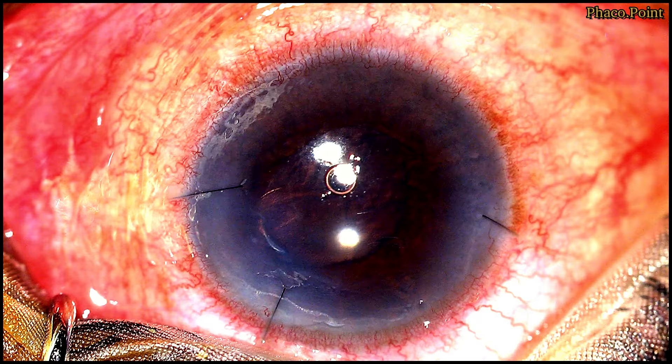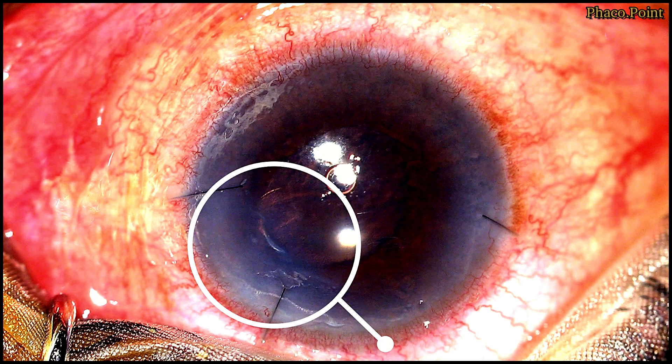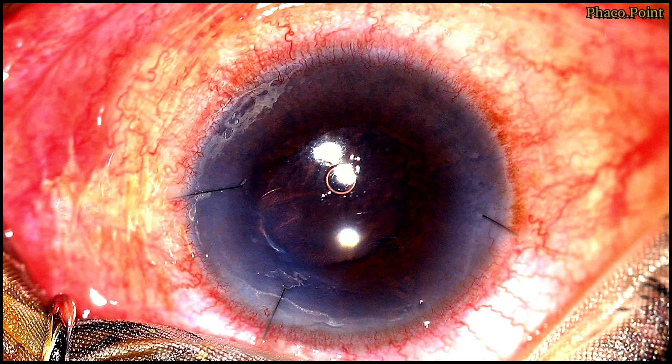Let's move to watching the surgery. In this case, you can see the area of corneal haze lying between the 12 and 3 o'clock position, which corresponded to the area of the DMD. Let's now see how we settle this Descemet's membrane detachment.